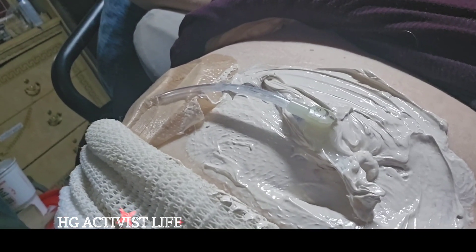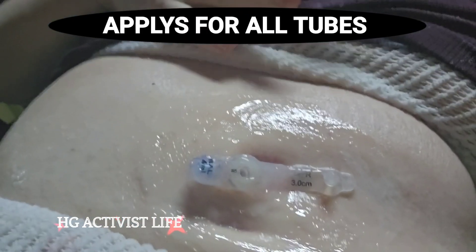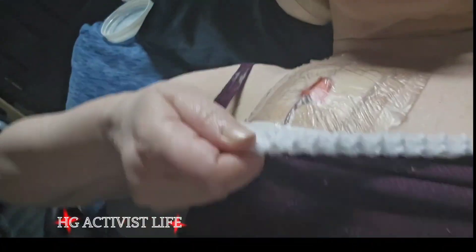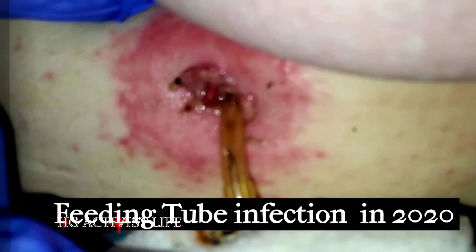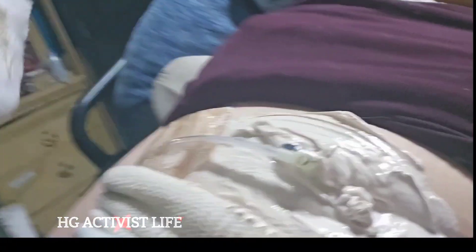You may think that's excessive, but you have to do that in order for your stoma to be healthy. I'd rather cake cream on and have a beautiful stoma — look at my stoma, we just swapped out and there's no redness or anything whatsoever. I became allergic to the pads and gauze, so the mesh that you get with a PICC line — Robert figured out we could use that — it holds the moisture because your stoma needs to be moisturized and in a wet environment. That's one of the biggest mistakes nobody really knows about.